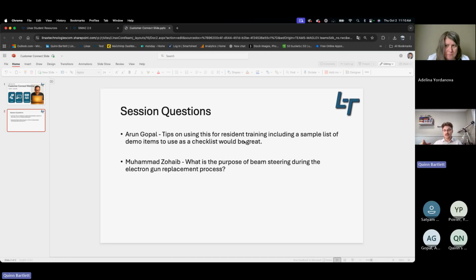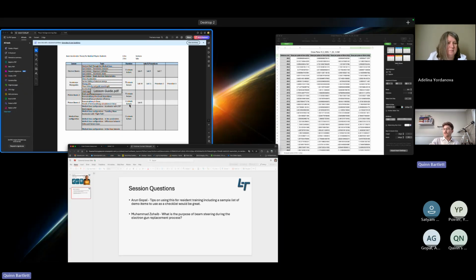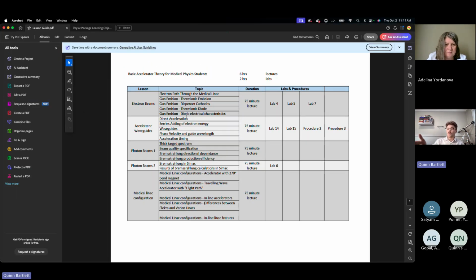We're really working to create these documents because we have a ton of content and the simulators are difficult. So we want to have a one-to-one map of these programs, so that you can get our package, say these are the modules we want to learn, and then just assign that to students or trainees. What I'll show you is what we have right now, and it'd be great if we could get some feedback, or I can make some suggestions of what we can do.